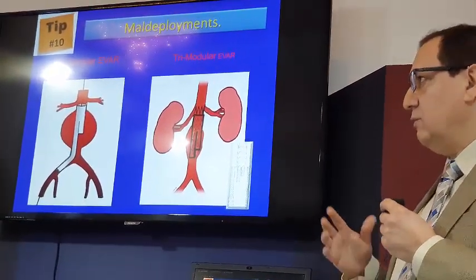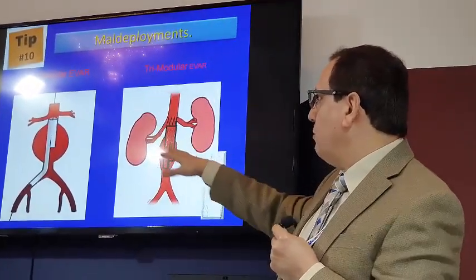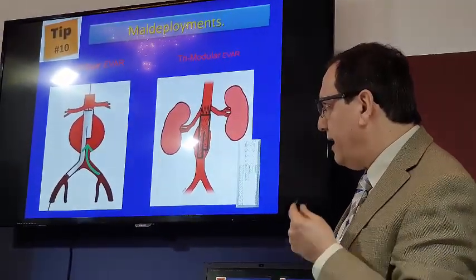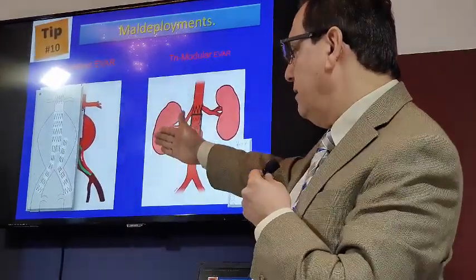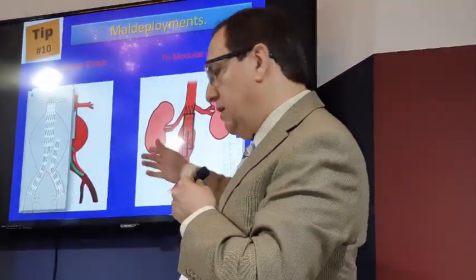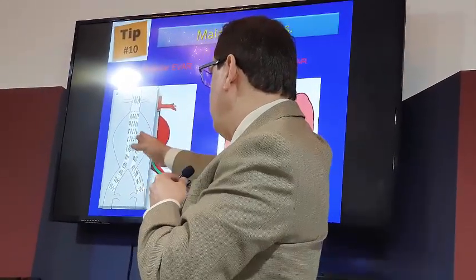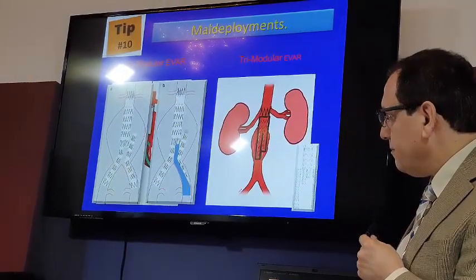What happens if you deploy it outside? We have two types of devices. We have a bimodular, we have trimodular. If you have bimodular, you're supposed to go the right way, but you can go the wrong way, you can deploy it behind it. So what happens, you end the limb completely outside. The best way to deal with that, you get the wire back, push it down, and put a new limb, and you leave the other one outside like that.